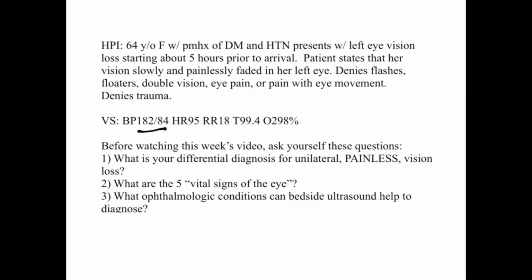Before watching this week's video, ask yourself, what's the differential diagnosis for unilateral painless vision loss? What are the 5 vital signs of the eye? And how can ultrasound help us diagnose ophthalmologic conditions?